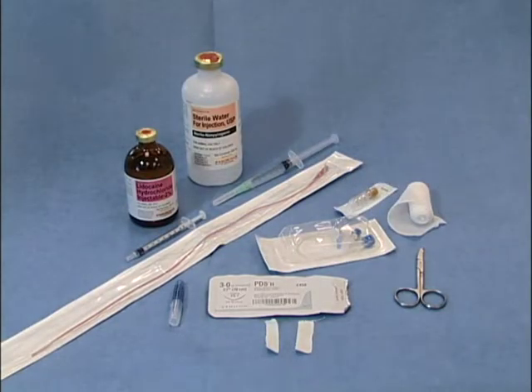This is the equipment needed to place a nasogastric tube in a cat. We have 2% lidocaine in a 1 cc syringe, sterile water for injection in a 3 cc syringe, a 5 French red rubber catheter, a 22-gauge needle, 3-0 suture material, some white tape, suture scissors, a T-set, an injection port, and some plain white gauze.